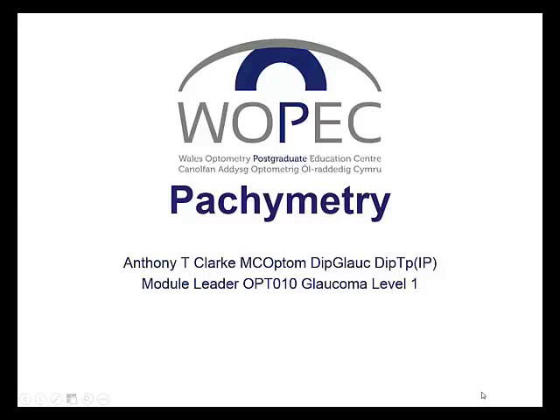What is GAT? Goldman Applanation Tonometry, sometimes referred to as GAT, is considered the gold standard technique for measuring the intraocular pressure. However, it is a flawed technique as it does not take into account the effects of the cornea on the IOP measurement.